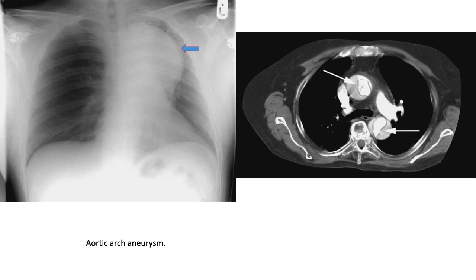This is another cardiovascular example: aortic arch aneurysm. On the right is a CT scan of the aortic arch aneurysm, showing atheromatous plaques indicated by arrows. These atheromatous plaques are causing severe dilatation of the aorta.